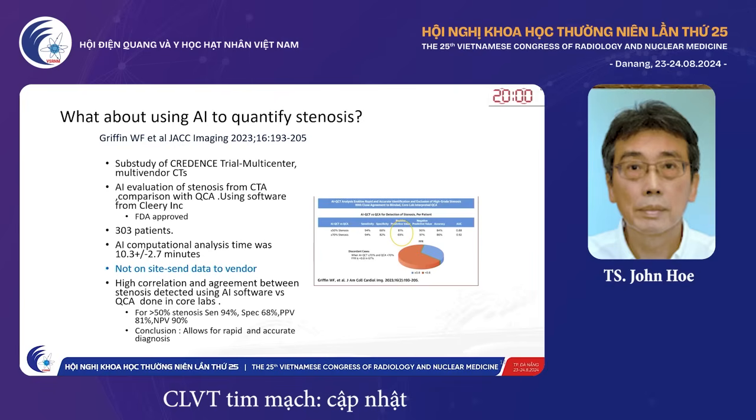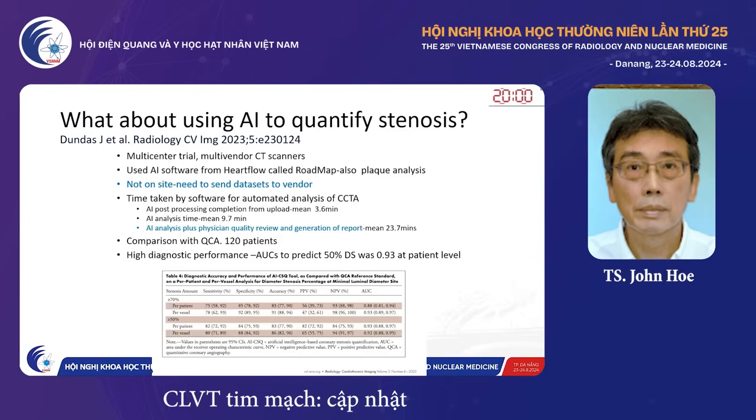However, this software was not on site, and all the data had to be sent to the vendor. This is another paper published last year, again, multi-center trial with 4 major vendor CT scanners used. They use software from HeartFlow. Again, it's not on site and need to send the data sets to the vendor. Again, the time taken to analyze the software was very fast, but it still needed to be checked by a doctor before the report was released. And again, the accuracy is high.